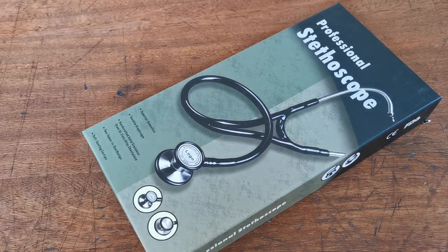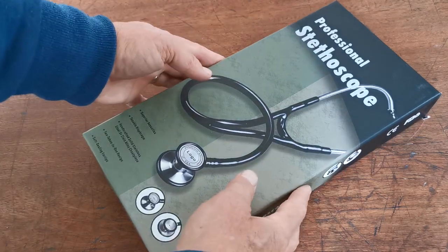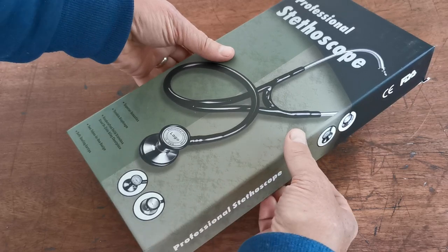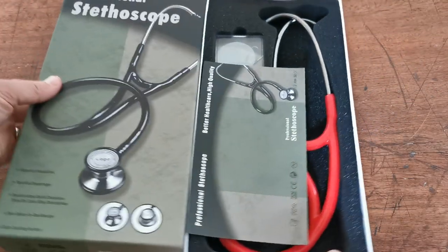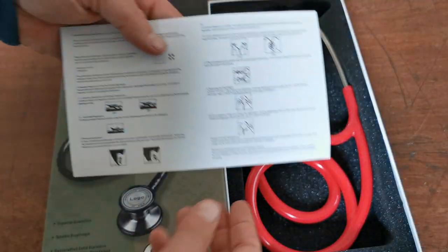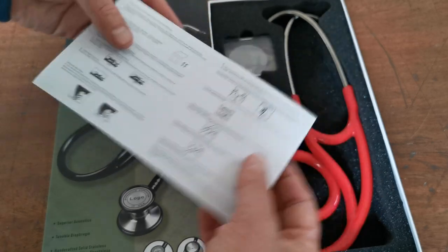Welcome to this Value Med presentation. This cardiology stethoscope is an item we've been selling for some time now. The outer packaging is as it's going to be presented to you. Standard CE and FDA boxing certificates on this are all as you would expect for a medical piece of equipment. There's also a standard insert with some basic guidelines and setup, usage, and storage information.